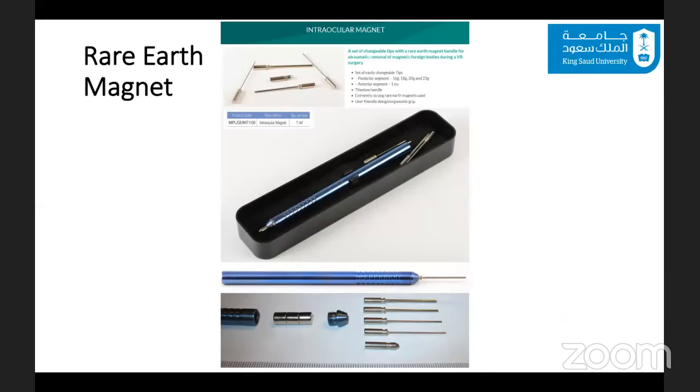The rare earth magnet is available in many gauges. The problem is you need a short working distance in order to hold the foreign body.